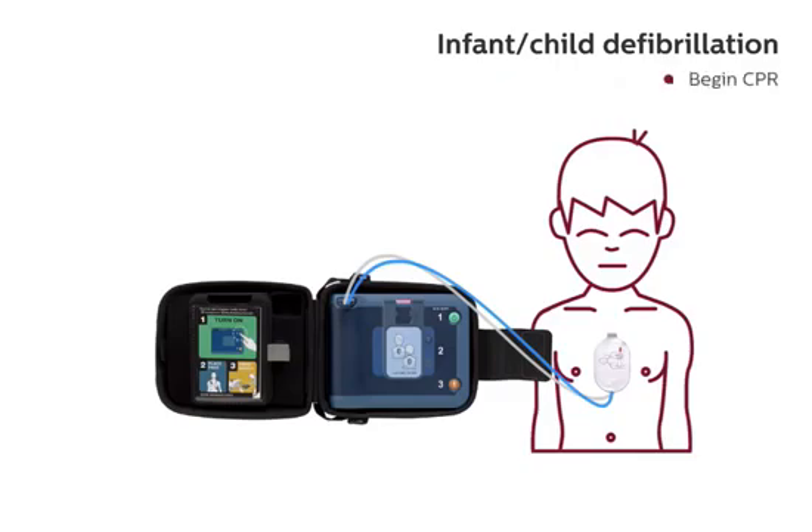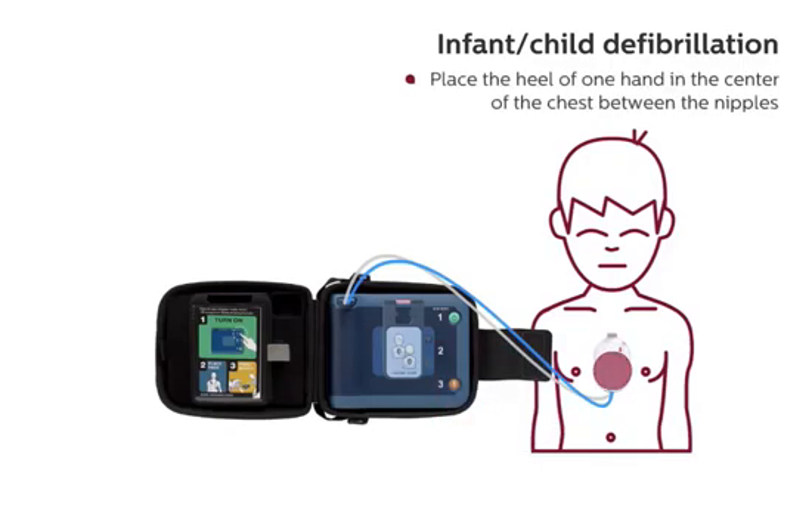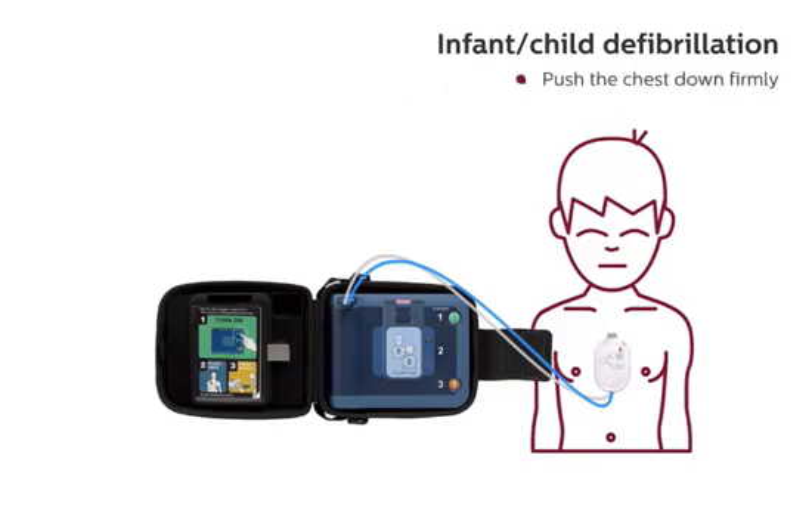It is safe to touch the patient. Begin CPR. For help with CPR, press the flashing blue button. Place the heel of one hand in the center of the chest, between the nipples. For patients less than one year old, use two fingers instead of the heel of your hand. Push the chest down firmly. Keep time with the beat.